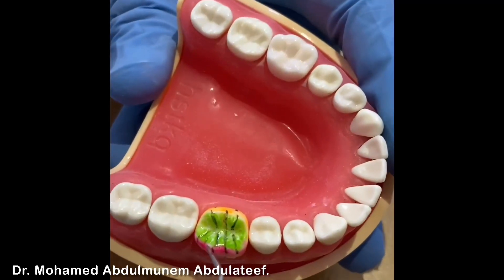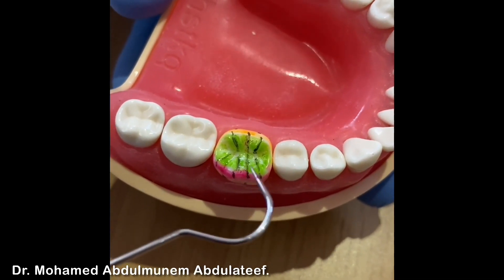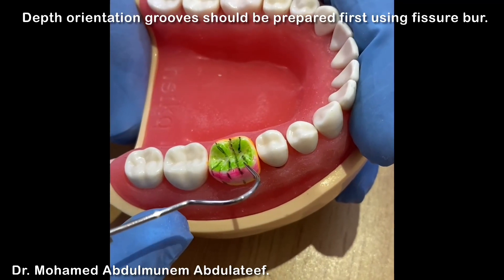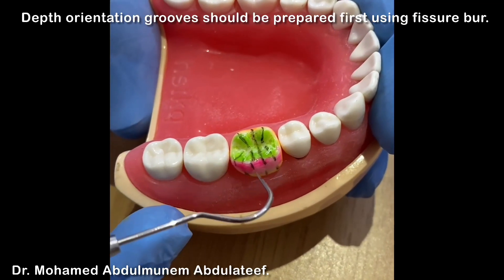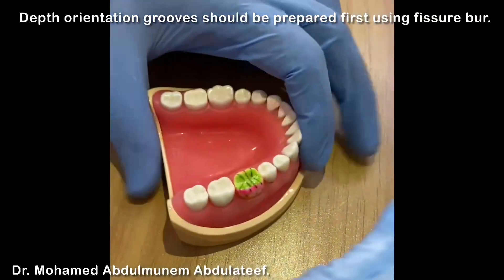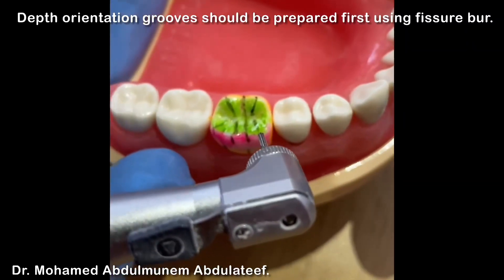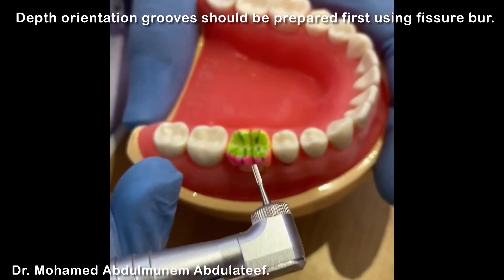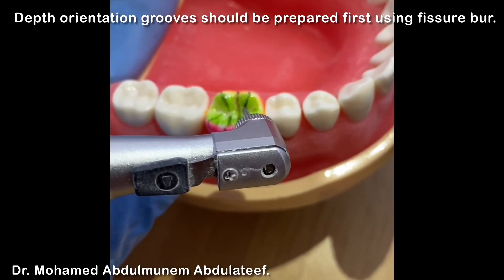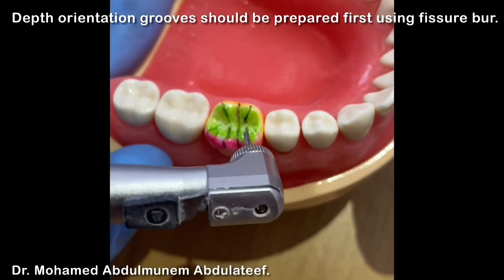The green color represents the occlusal surface and we'll do the occlusal reduction. We'll start first with the occlusal reduction. These marks we put on the inclination of each cusp and on the developmental grooves. Now we'll do the grooves using a Fischer Bur. We are preparing the depth orientation grooves. The position of the bur should follow the inclination of the cusp — it should not be horizontal or vertical, it should follow the inclination of the cusp.